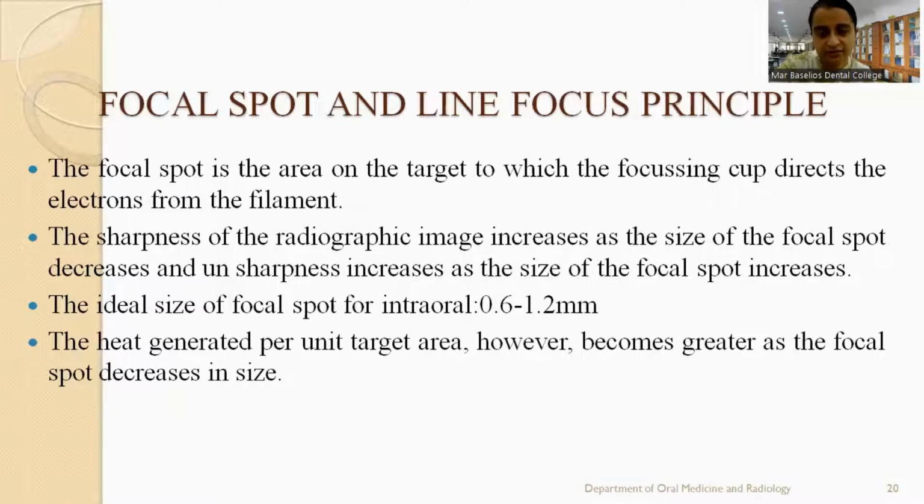Now, what is a disadvantage in keeping a small focal spot size? The heat generated per target area will be very high. So that is a disadvantage.